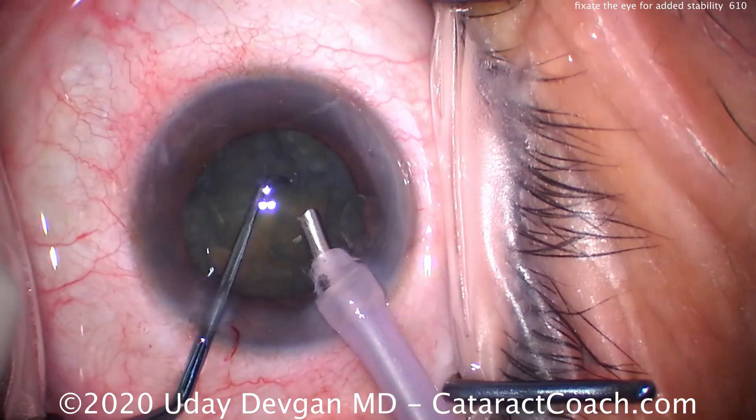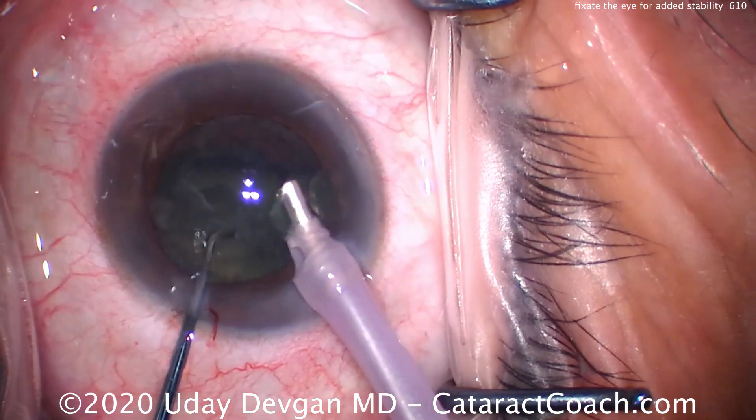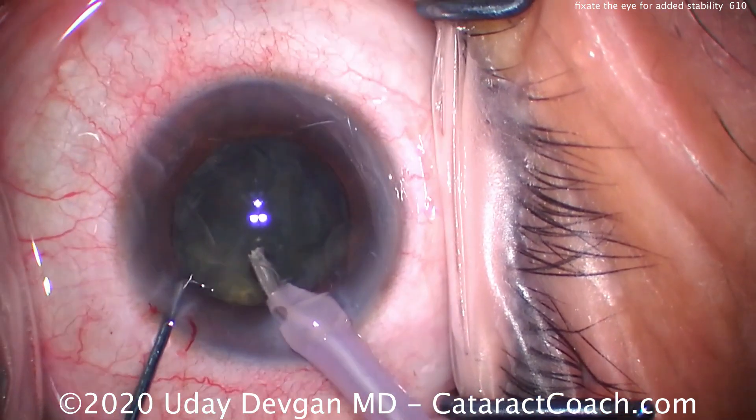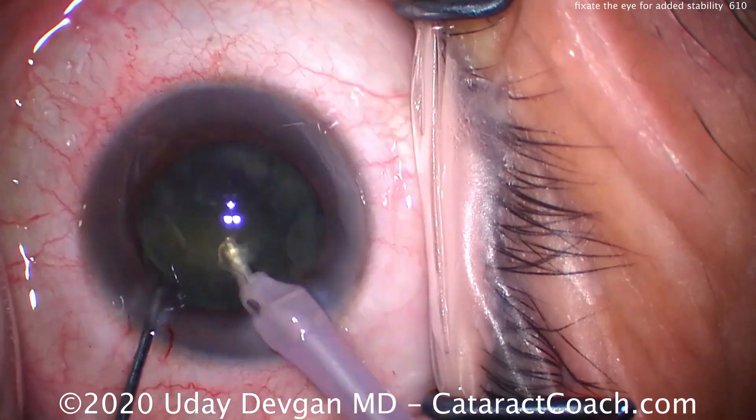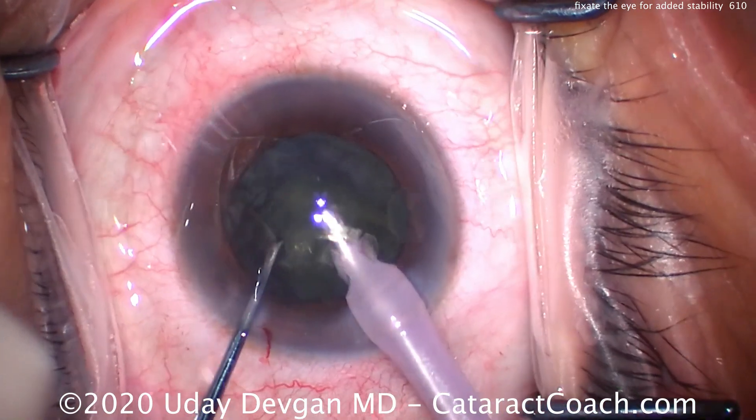This is a lot more comfortable for the patient and it's also a lot safer for me. By having two instruments in the eye, that's a very stable environment. Taking out the rest of the cataract here looks pretty good.